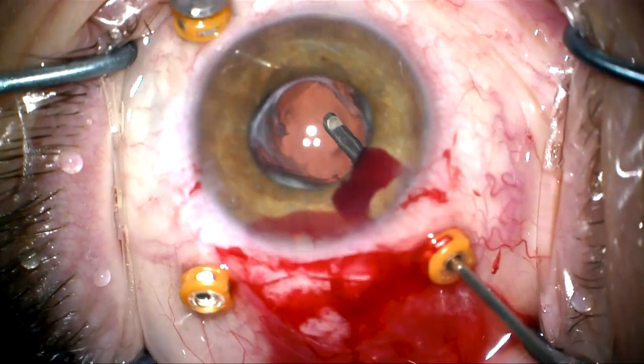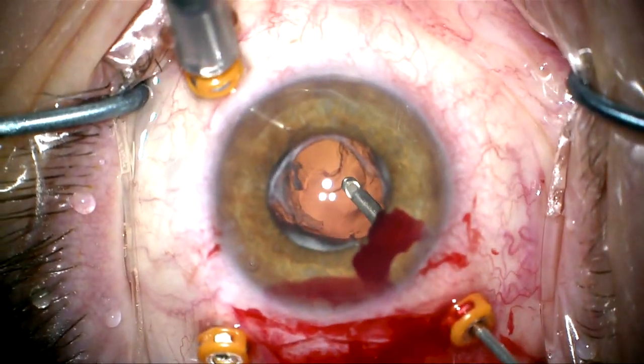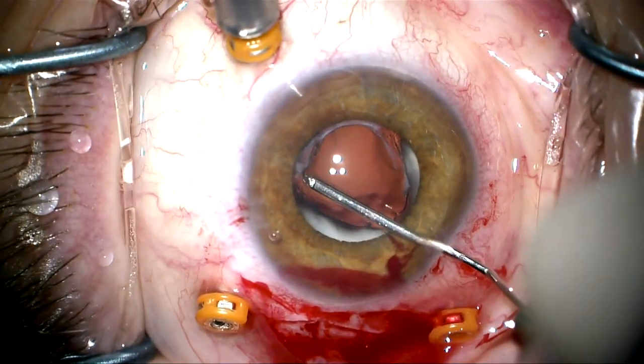We're going to do a vitrectomy here and clean things up a bit. Note: some previous vitrectomy was edited out.